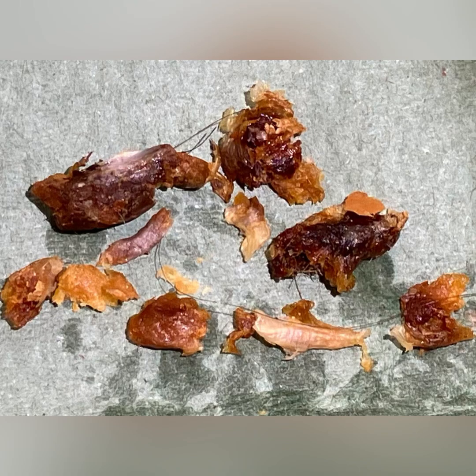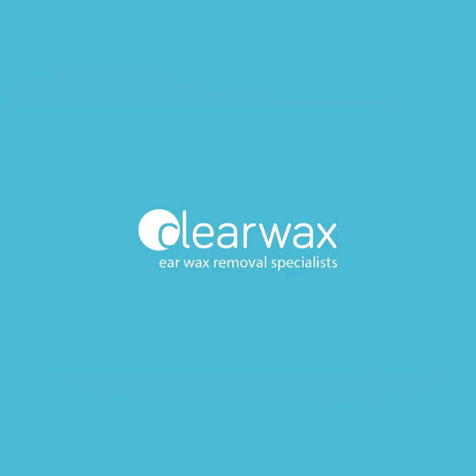Nice and clear. You can see this patient has quite a bony spur near the eardrum — if you watch the other video using the iClearscope, it'll probably be a bit more noticeable because you can see the whole ear canal in perspective. That was all the dead skin debris that I removed. I hope you enjoyed that video. If you are interested in the Waxcope, please do email info@clearwax.co.uk. Bye.